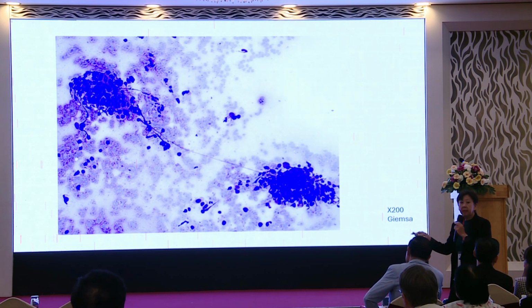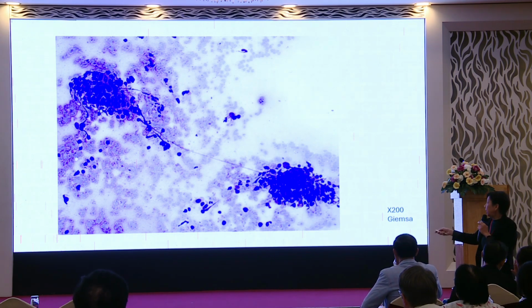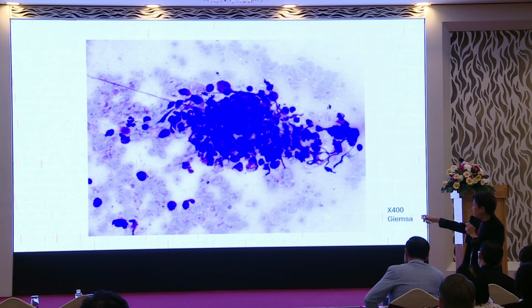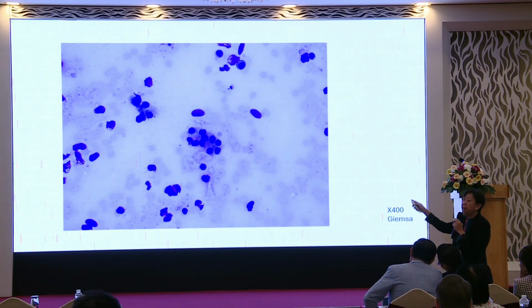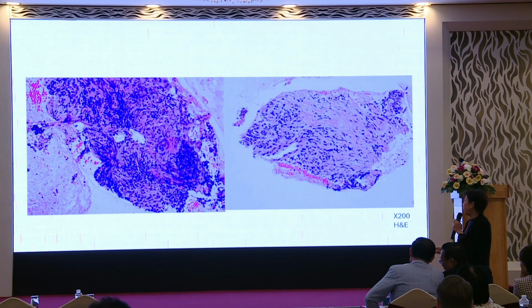And they fragment, and you see this lymphoid dirty background in the background. You can see the fragments in the background. So this little fragment should tell you that this is a lymphoma. But mixed with it, you see pancreatic tissue. So you just need to identify what is glandular and what is lesional.